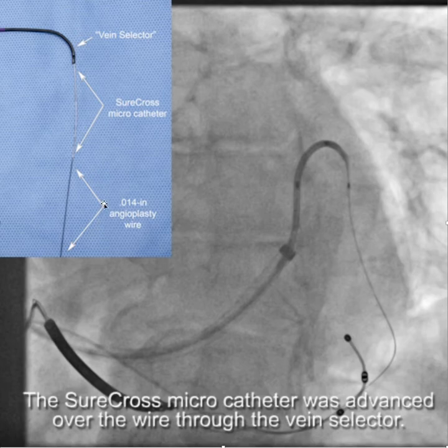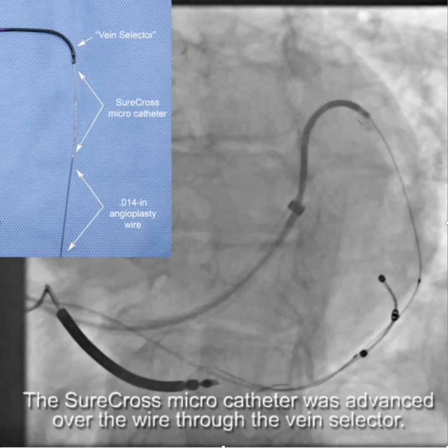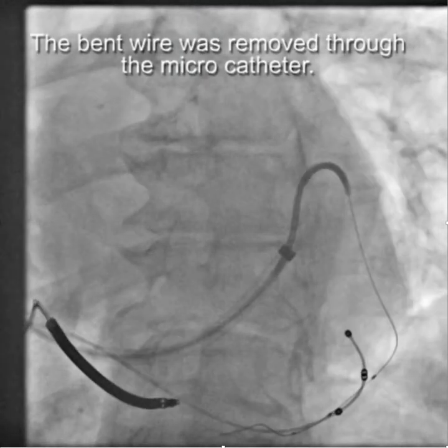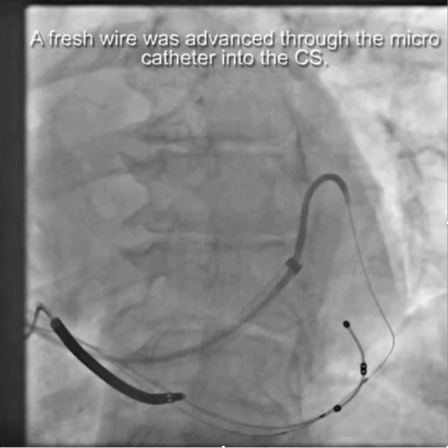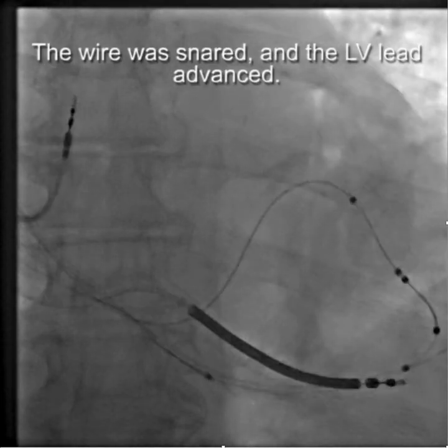What we did was take the wire adapter off the back of the vein selector and then advanced the SureCross over the wire — that's what this is here — and advanced that down. Now the SureCross is through the collaterals, so you can safely remove the wire and replace it with a fresh wire without fear of not getting back through the collaterals. Now you can see the wire passes easily back into the coronary sinus, and then we snared and got the lead in.